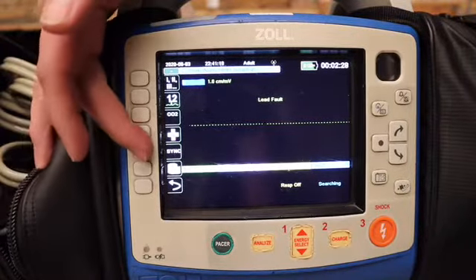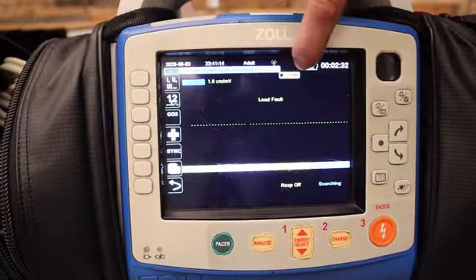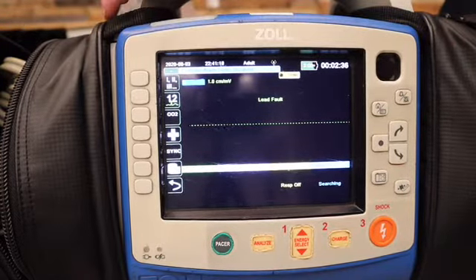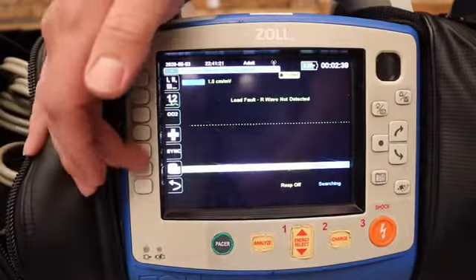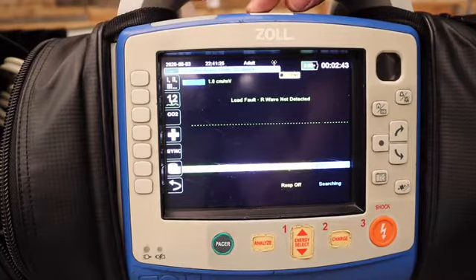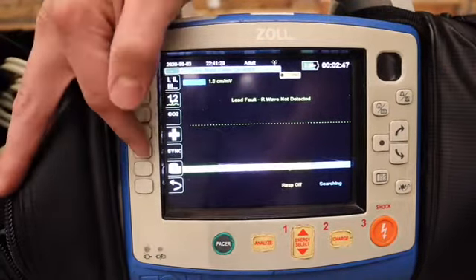We have the sync function. This button — you notice sync comes up — is used for synchronized cardioversion. This has to be pushed each time that we defibrillate with synchronized cardioversion. If we don't have it on, then we run the risk of causing more issues.